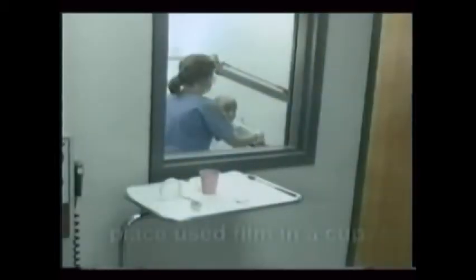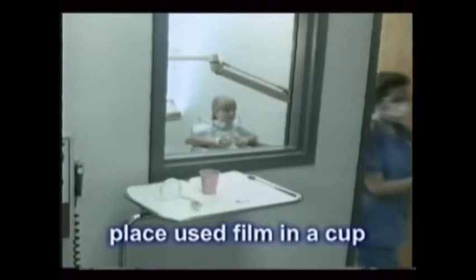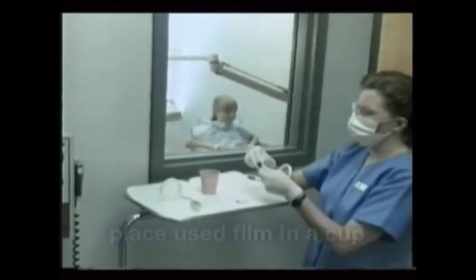Herringbone or honeycomb patterns on developed film reveal that it was placed in the mouth backwards. The film will also be too light. The pattern comes from the beam passing through the thin lead foil backing of the film. Finally, multiple overlapped teeth mean that the film was exposed to the x-ray beam twice in two different areas of the mouth. Careful exposure habits — placing used film in a separate cup from the clean films — prevents a film from being double exposed.